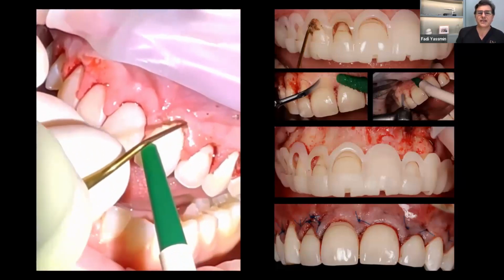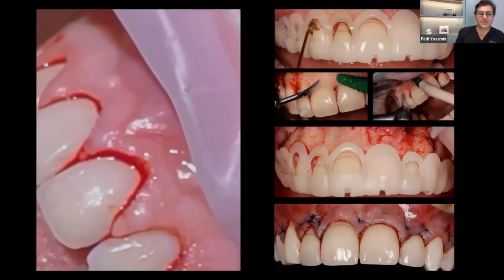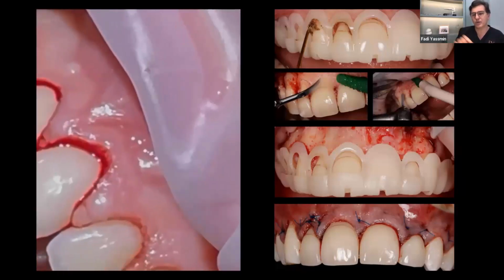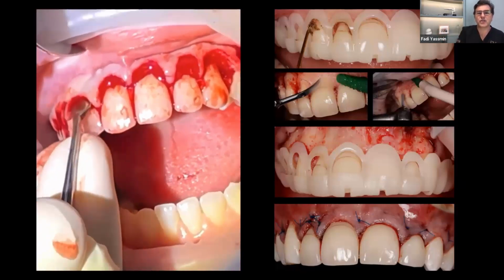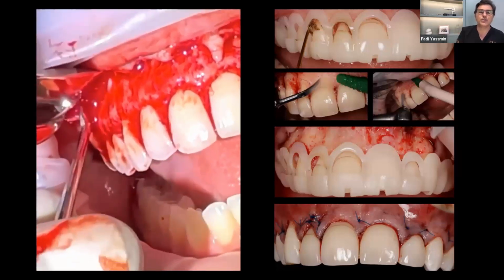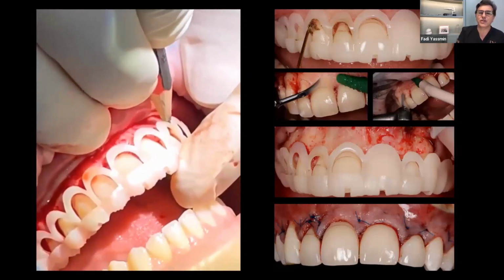And once we've done that and we've got our proportions, now these gums won't stay there if you don't go to the next stage and actually reduce the bone accordingly, where in this particular case, across on the left, the bone is reduced anything from 2.5 to 3 millimeters. So not only at the margin, but also in between.